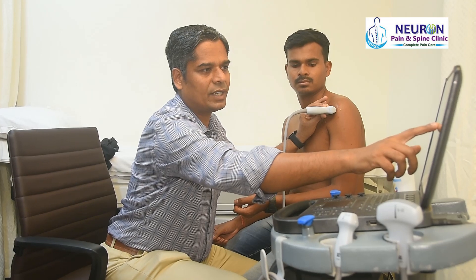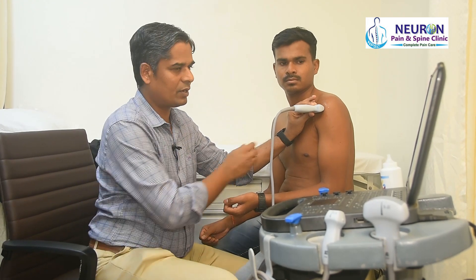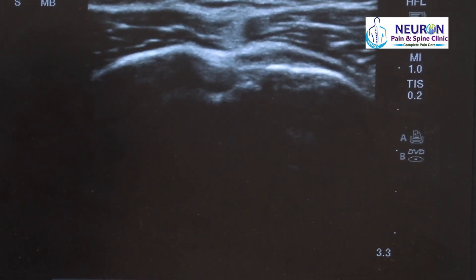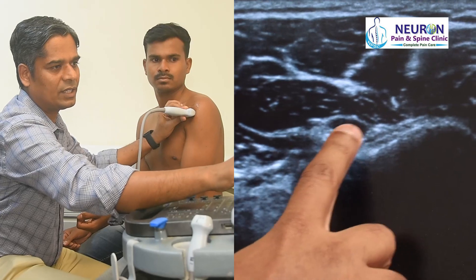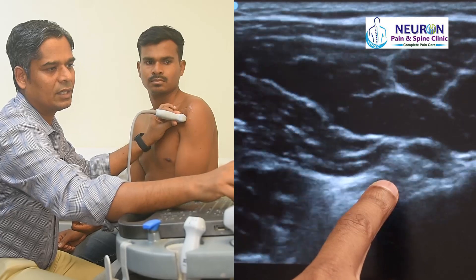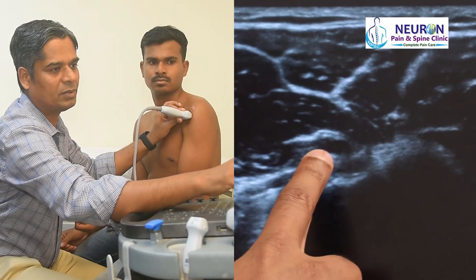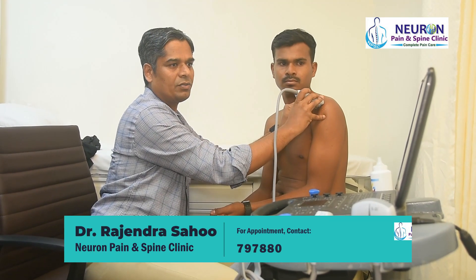On top of that tendon, one can see a hyperechoic line — that is the transverse humeral ligament. I can see the tendon nicely and there is no fluid. Going up and coming down, the deltoid muscle is visible. This tendon is slowly becoming the muscle, and on the medial side you can see the pectoralis major tendon. As I slowly go up, a bit of the tendinous part comes up — scanning in this manner to see the rotator cuff interval.